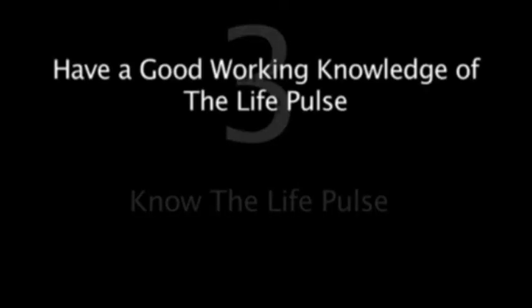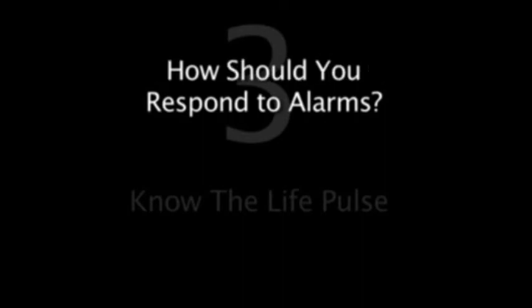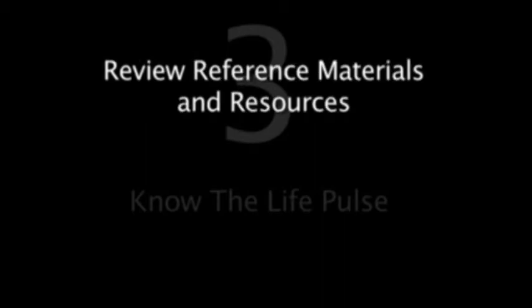Third, know the LifePulse. Interpreting alarms is difficult, if not impossible, without a good working knowledge of the ventilator, how the feedback control mechanisms function, and really what the various alarms mean. What conditions can cause an alarm? Be aware of that. How does the LifePulse respond to an alarm? How should you respond to an alarm? These are all very important concepts. Review this video and study the operator's manual and the in-service manual. Become very familiar with the ventilator and all the resources that are available to you that might help troubleshooting.